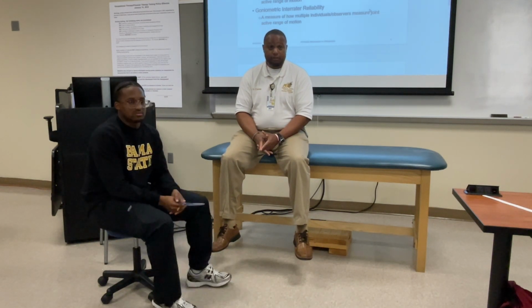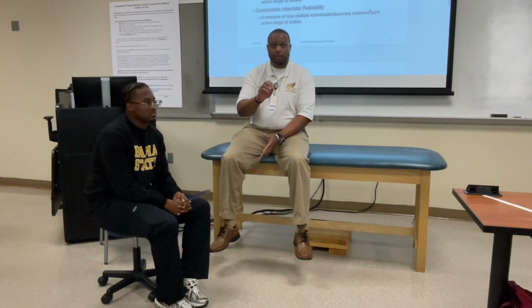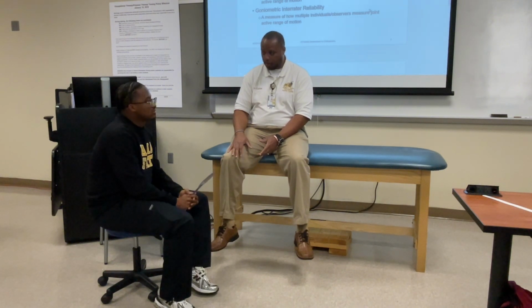So, would that be good intra-rater reliability? Yeah, he got about the same thing each time. The only difference, in the first one he got 0 to 25 degrees. Now that could be due to being cued not to move the stationary arm. It also could be due to your patient. The more times they do it, they may get better range of motion. But I felt like I got the same range of motion each time because my hips are still. I've got tight iliopsoas muscles that I'm going to get y'all to work on eventually.